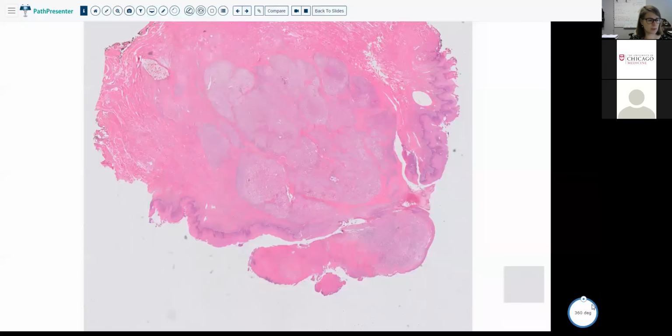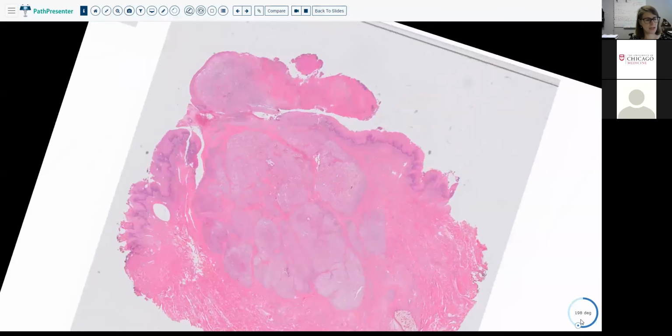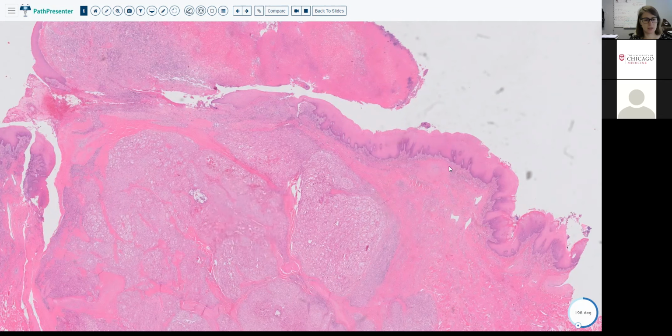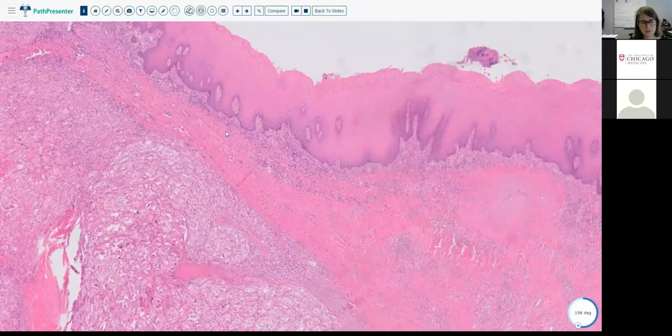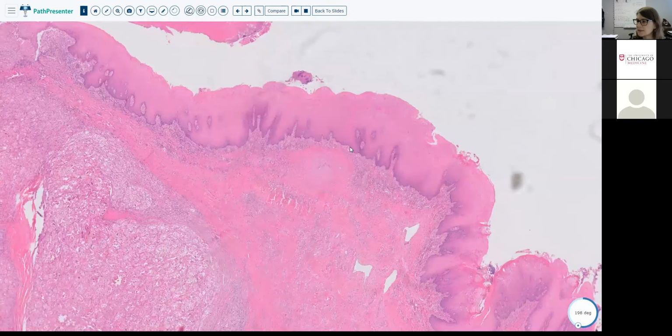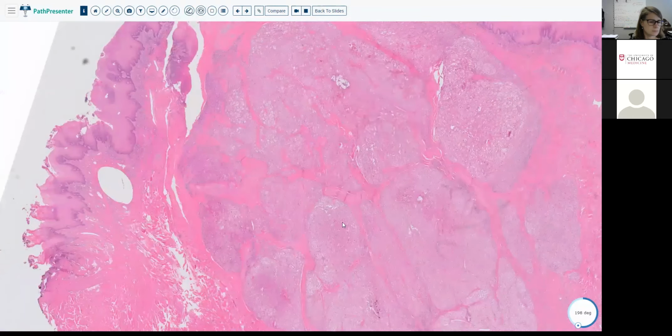All right, the next one I'll drive, but someone who's not Tim is going to describe. I'll tell you already that we are in some squamous lined site where I do not see skin adnexae, so I assume we are in a mucosal site.